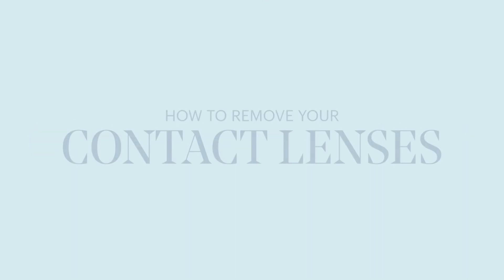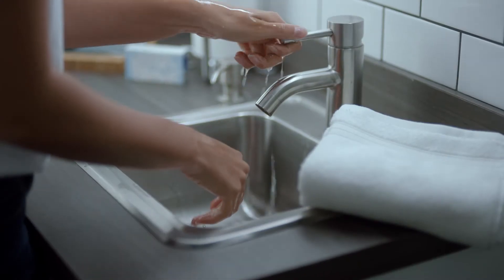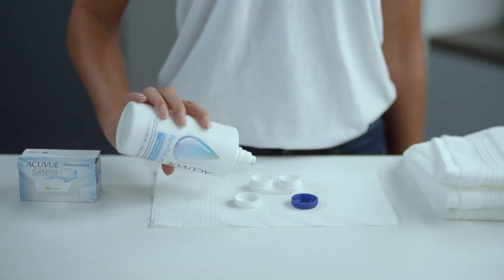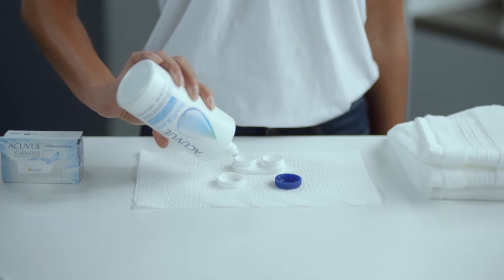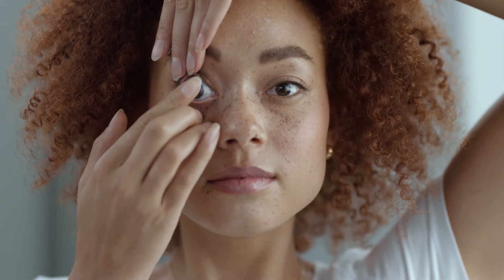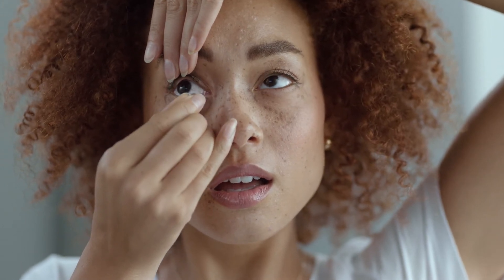Congratulations, you did it! Now that you know how to put them on, taking off your contact lenses should be a breeze. First off, start by washing and drying your hands with a lint-free towel. Then rinse your contact lens case with a multi-purpose disinfecting solution and fill it with solution. Now you're ready to take your contact lenses off. Just like when you put them on, start with your right eye. With one hand, look up and pull down your lower eyelid. With your other hand, bring your index finger close to your eye until you touch the lower edge of the contact lens. Slide the contact lens down to the lower part of your eye and gently use your thumb to remove it.